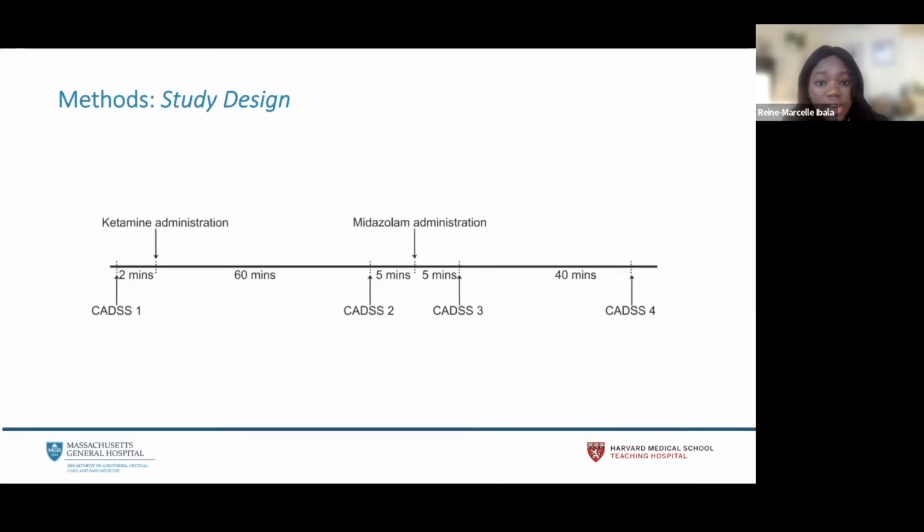So looking at a diagram, you can see here that we conducted the first CADSS assessment at baseline. After about 2 minutes, we administered the 2 milligrams per kg bolus of ketamine.